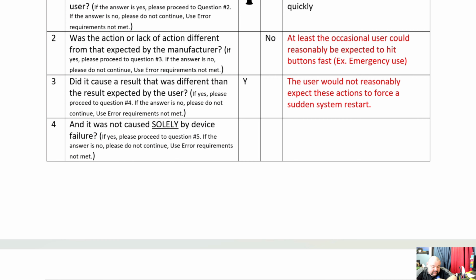That one I think is plausible because it's 100%. So the correction to this is a change in the design of the device. They're updating software revisions. They're pushing a patch to fix this. Could you add an alarm? Maybe. A warning pop-up. Says, whoa, slow down, partner. And is there information related to safety about this? Well, we could just slap a warning in the IFU that says, hey, push buttons too fast, the whole system's going to restart.